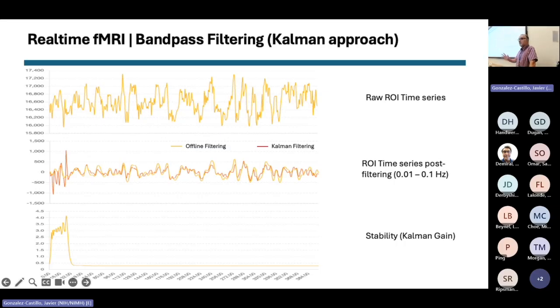Again, you're going to have to do these things to say, okay, if I'm doing all these things, it's only after this many seconds that I have data that I can reliably use for my neurofeedback or whatever it is. It's also really good practice that you make all these decisions through piloting, you acquire your data with the best possible set of things. But then later on, whatever inference you're going to do about what happened, also analyze your data offline and see how far away you were from the data, how much all these uncertainties that we have to live with really affected what the subject got or what drove the rest of the experiment.